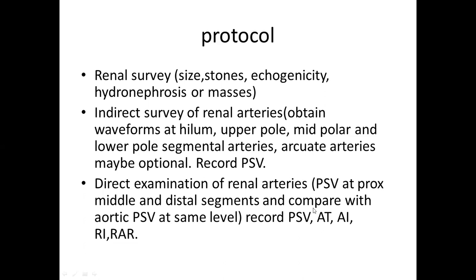The acceleration time is considered as the time to peak, which is the time from the start of the systolic upstroke to the first compliance peak of the wave. Then the acceleration index is just like, maybe I can call it dy/dx.